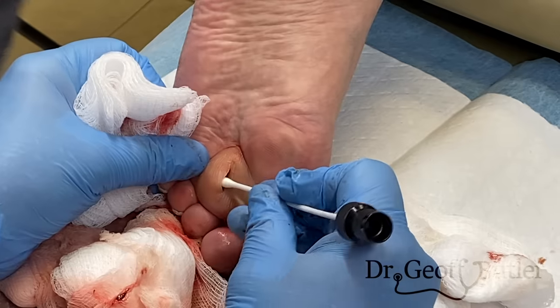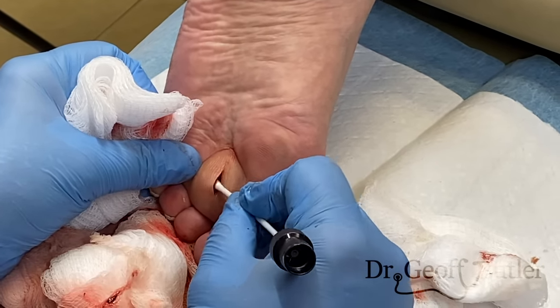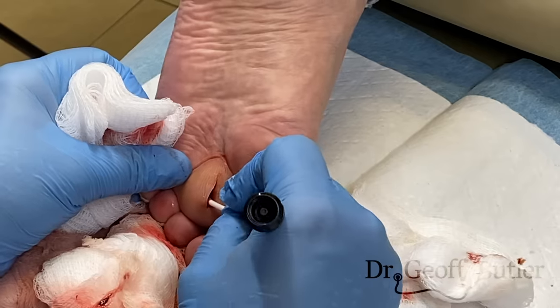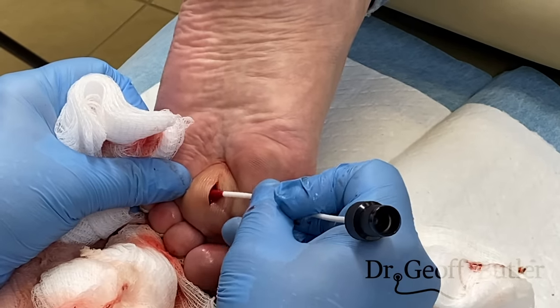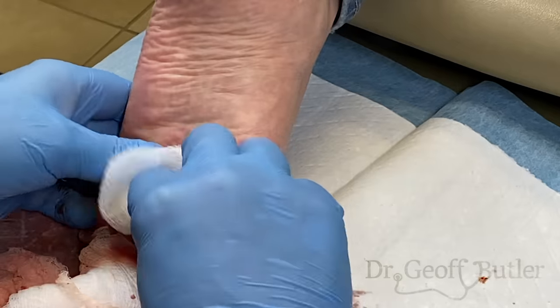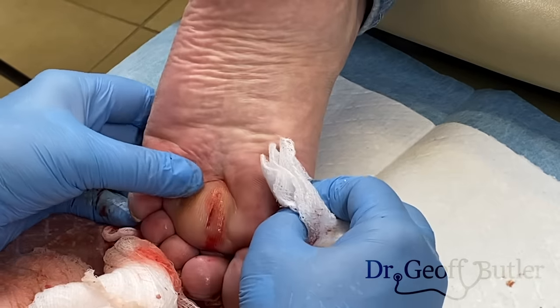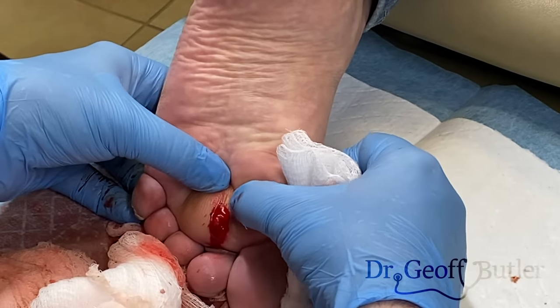Little pressure there — is that hurting? Not too bad. Because we're trying to find live bacteria here. That really sensed it all through here — this side, not so bad.